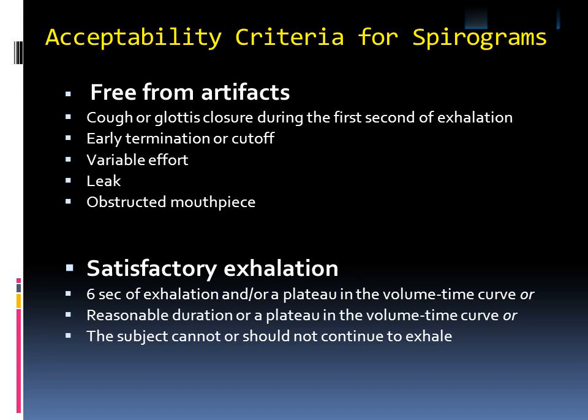Satisfactory exhalation: 6 seconds of exhalation and/or a plateau in the volume time curve, or a reasonable duration, or the subject cannot or should not continue to exhale. Good start: extrapolated volume is less than 5% of FVC or 0.15 liters, whichever is greater, or time to PEF is less than 120 ms, optional until further information is available.